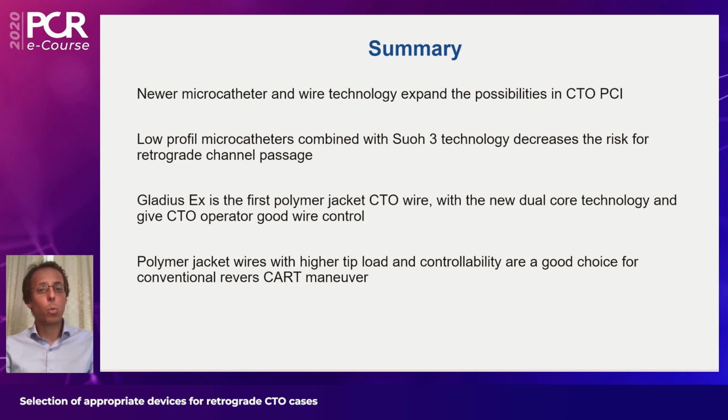And I think polymer jacket wires with higher tip load and controllability are a good choice for conventional reverse CART maneuvers. Thank you very much.